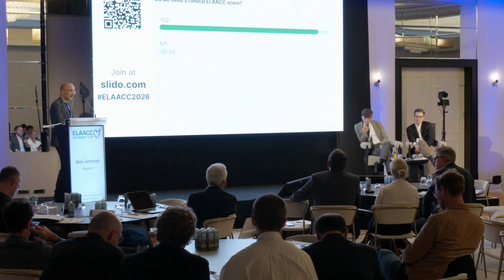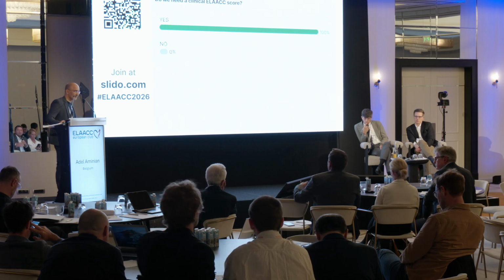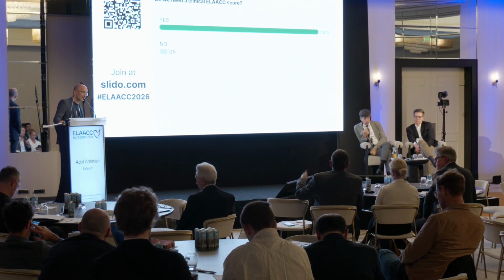If we want to improve our anatomical score, we have to go to the clinical one, as was done for the TRI-score, for example, where clinical variables, biomarkers and imaging that we already have are used to scale the complexity of the procedure. What we did is really great with the anatomical score, but then we can go to the prognosis of the patient.